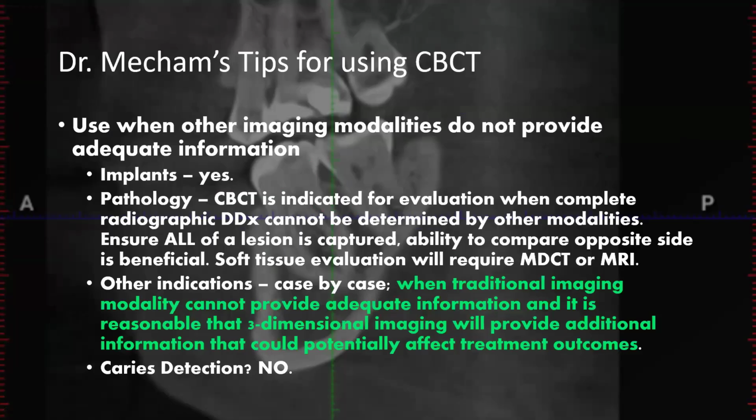If I just gave you a few bullet points on what to think when using CBCT for implants: yes, period, right? I think that one's a pretty straightforward one. A lot of that is influenced by legal cases I've seen. That line of questioning is going to come up if there's any complication with an implant, if that patient chooses to sue the dentist. It also is influenced by the fact that we have such low dose that the question is, why not? You have this CBCT that's maybe the dose of 2 intraoral radiographs, and in that mind, it kind of justifies people, in some cases, defaulting to CBCT, but especially for implant planning.